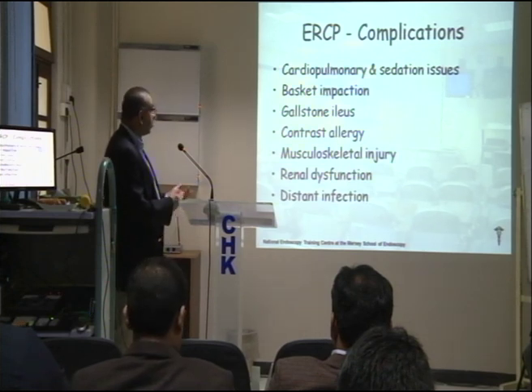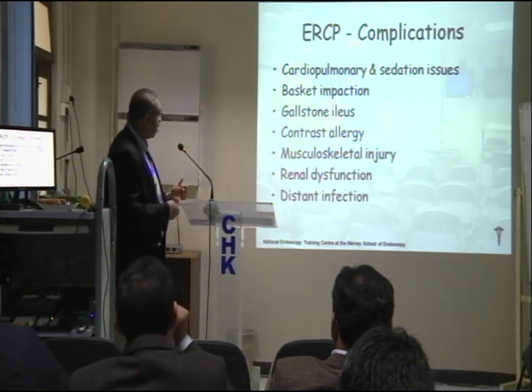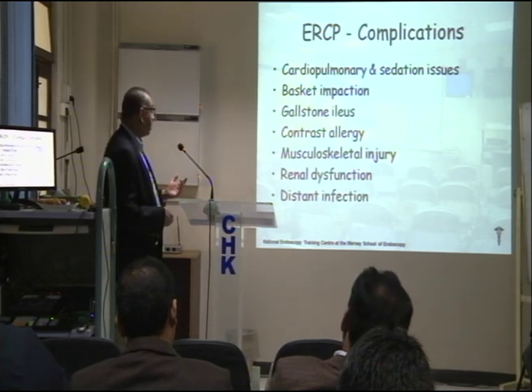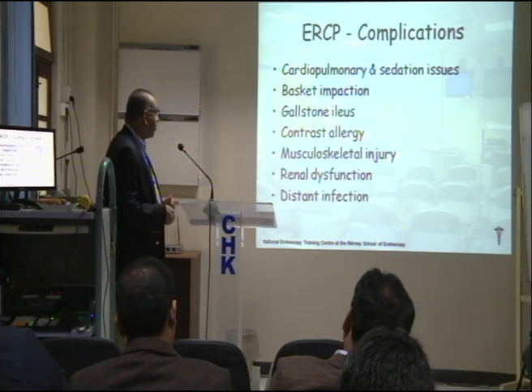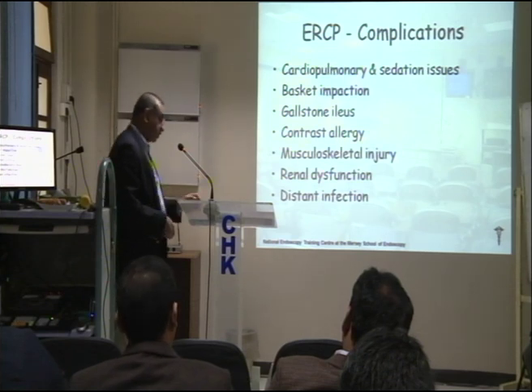Gallstone ileus can be caused by a big gallstone that you've removed and left in the GI tract. Extremely rare but possible. Contrast allergy is a possible complication. Musculoskeletal injury is possible in positioning, especially if they're lying on the side, they might get a frozen shoulder or nerve damage. Renal dysfunction due to high bilirubin level or dehydration following the procedure if you do not give them enough IV fluids. Distant infection is possible.